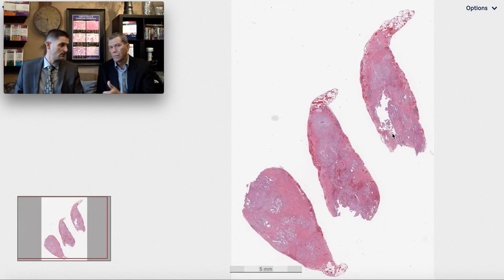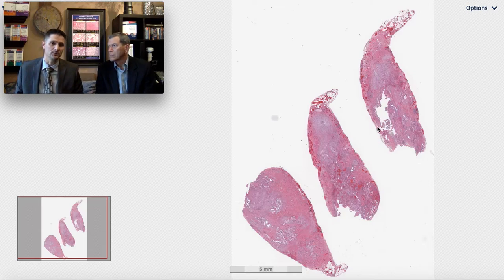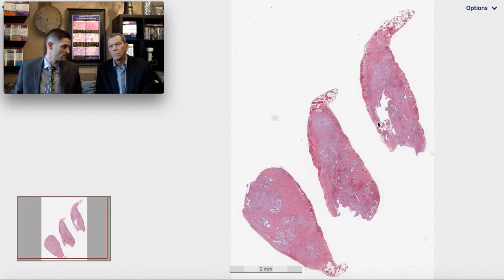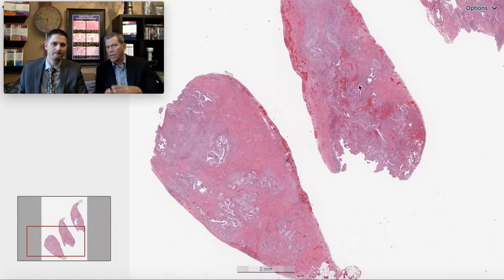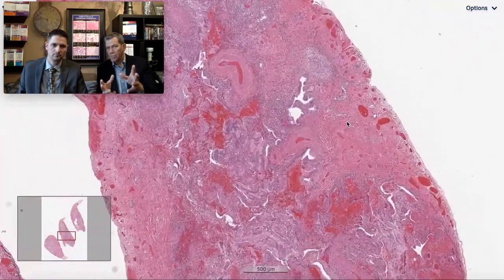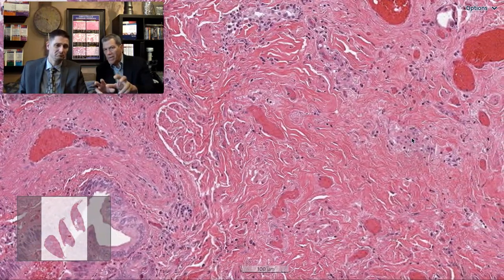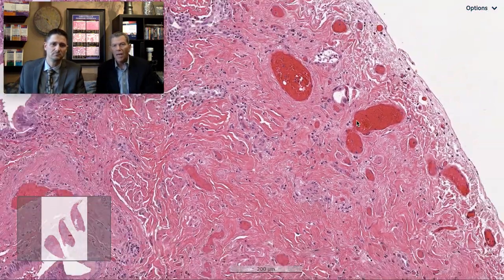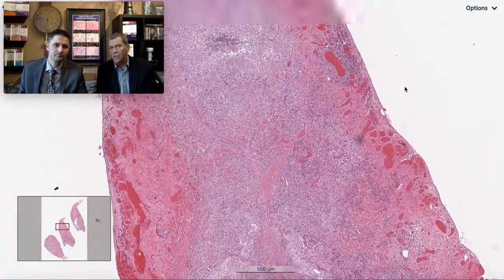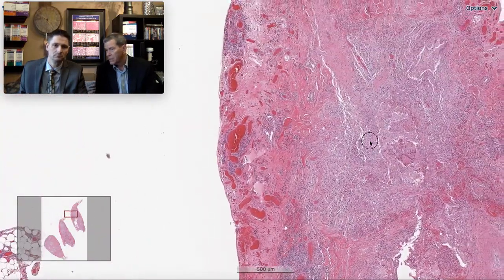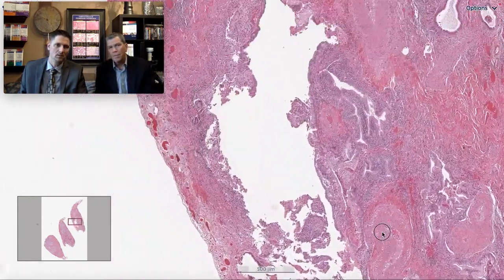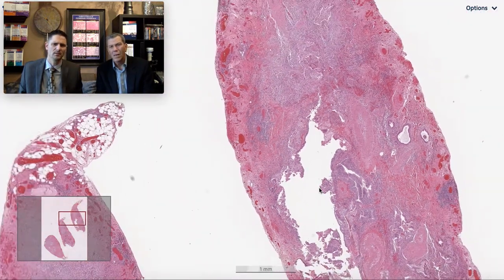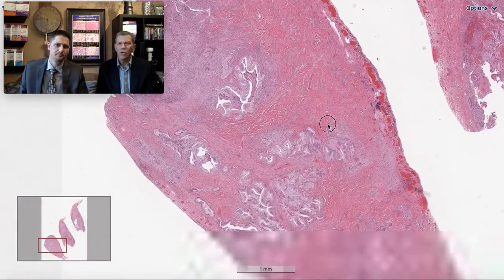This case came from upper, middle, and lower lobe biopsies — a typical ILD biopsy. These were the lower lobes. The biopsy is clearly abnormal: we've got large continents of scar evidenced by pink eosinophilic fibrosis, wiry dense collagen. This is a fibrotic lung disease — I'm okay with this being an IPF. It almost looks like end-stage lung; there's probably some honeycomb remodeling here — this is advanced fibrosis.